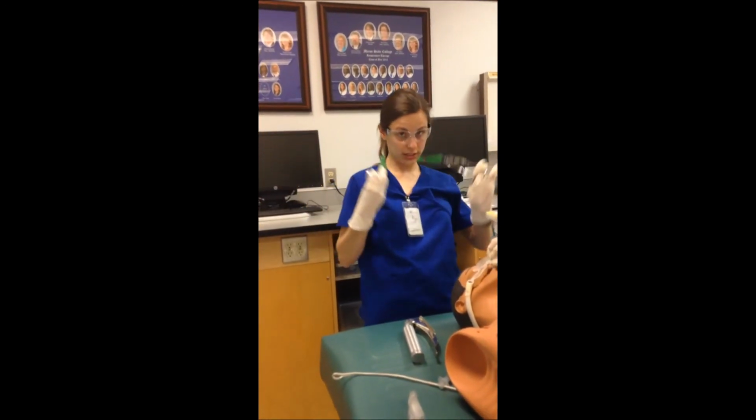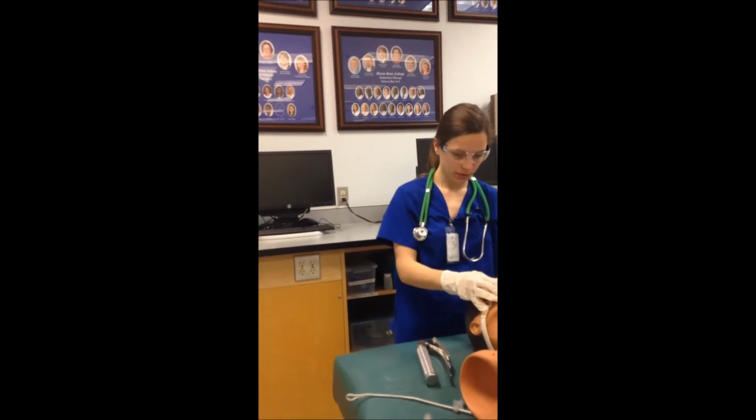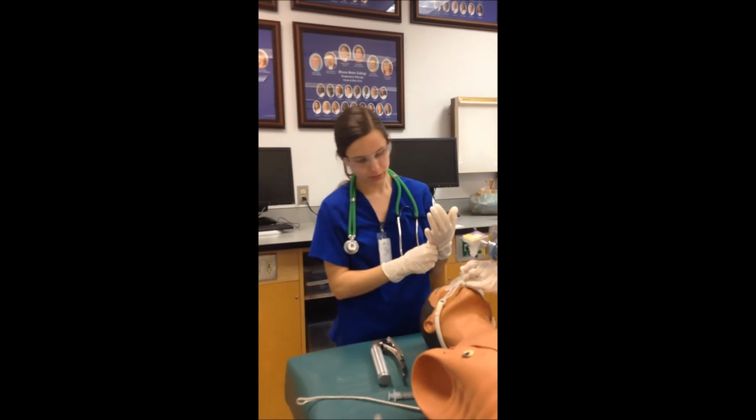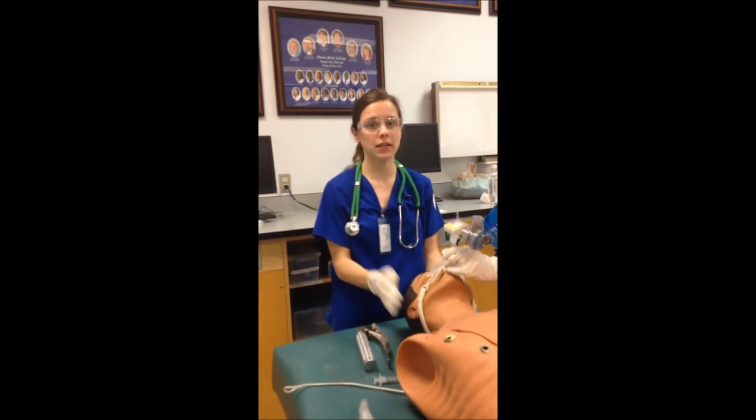We're going to order a chest x-ray. And check cuff pressure. We noted that we will check cuff pressure. Alright, we're going to continue to monitor this patient and set him up on the ventilator.